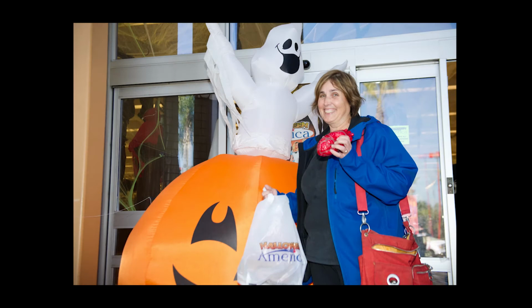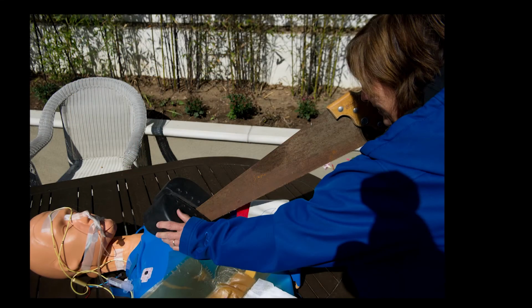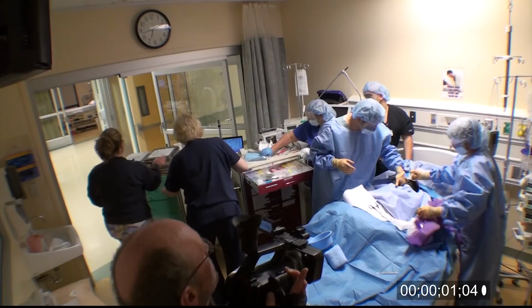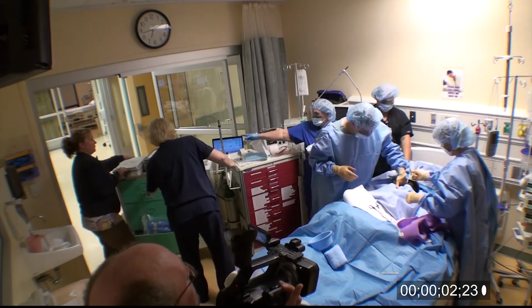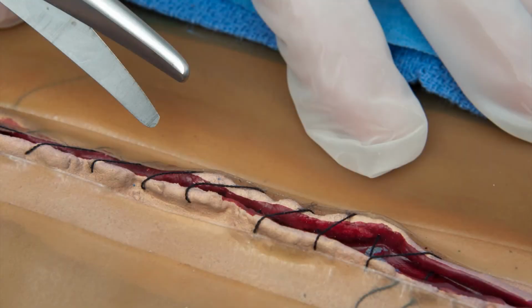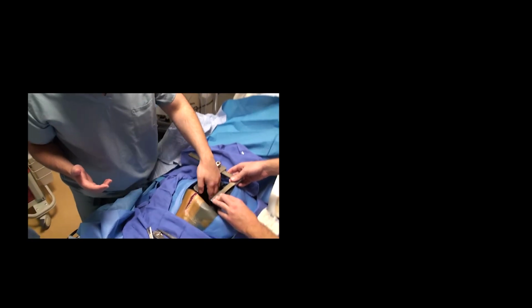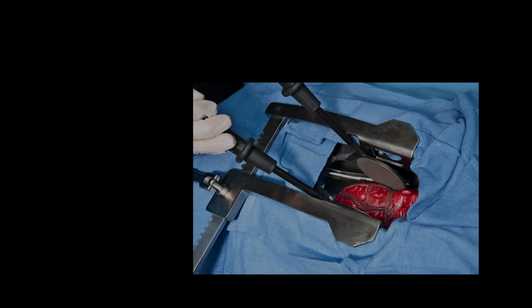In less than 4 hours, using a plastic heart and fake wound, we transformed an old CPR mannequin into a realistic simulation open heart patient that allowed for all the steps of the procedure to be performed in real time. The CPR mannequin was able to have its chest opened by cutting the suture of the chest incision, removing the sternal wires, and placing a retractor to reveal the heart, all in order to perform internal heart massage and defibrillation.